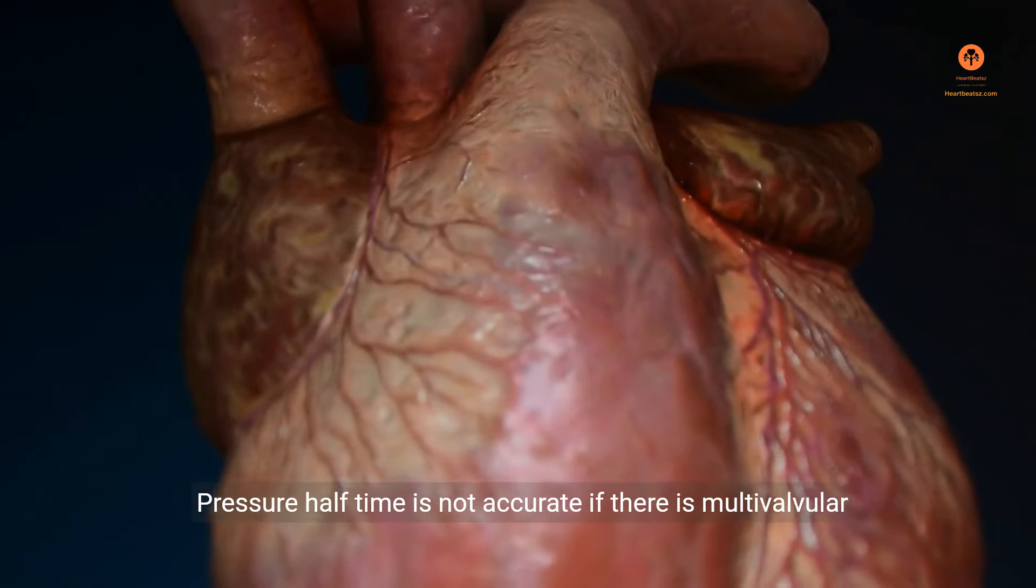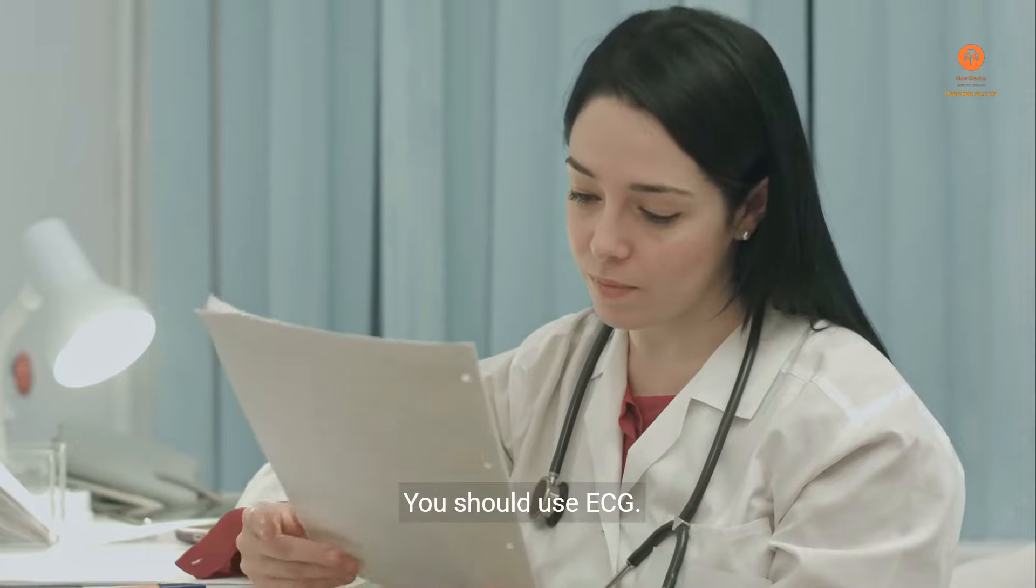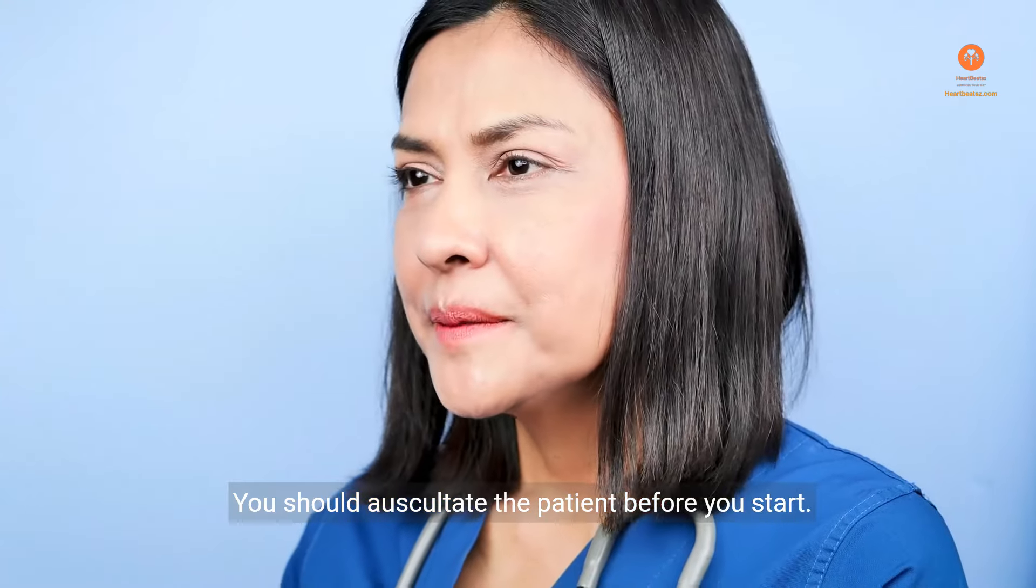Pressure half-time is not accurate if there is multivalvular pathology. You should use ECG. You should auscultate the patient before you start.